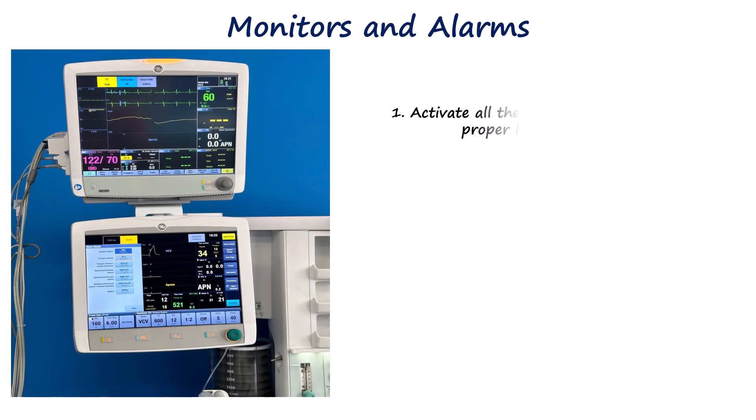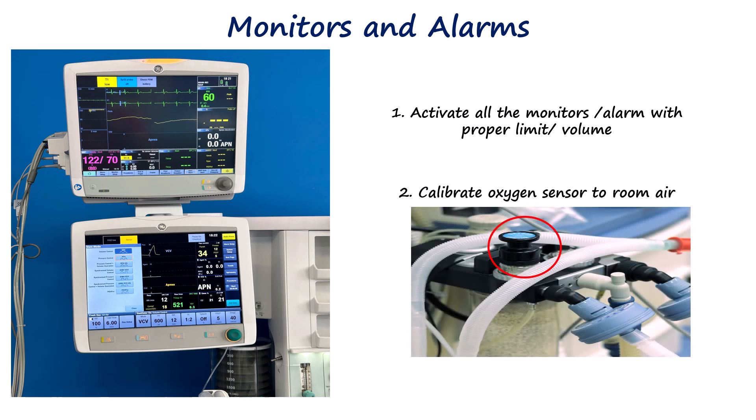All monitors should be activated, including ECG, SpO2, non-invasive blood pressure, end-tidal CO2, and anesthetic gas analyzers. Alarm limits should be appropriately set and audible alerts confirmed. Oxygen analyzers should be calibrated following the on-screen instructions.